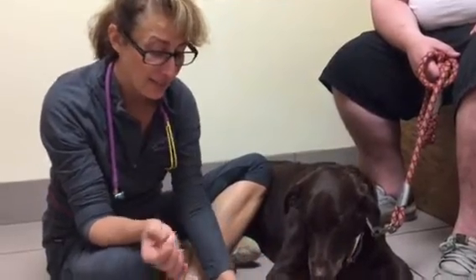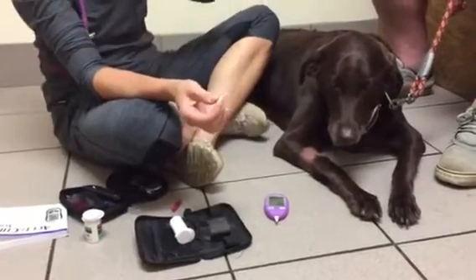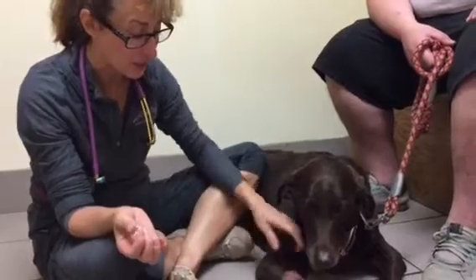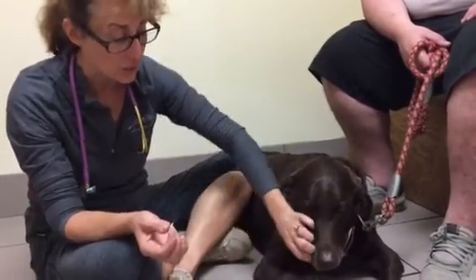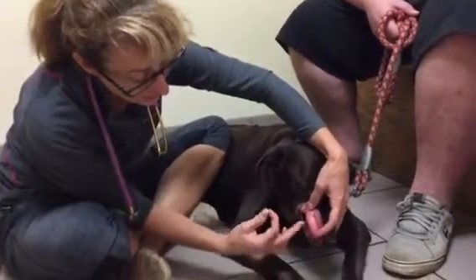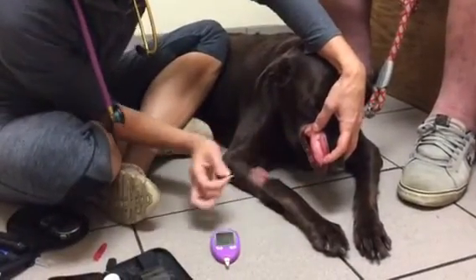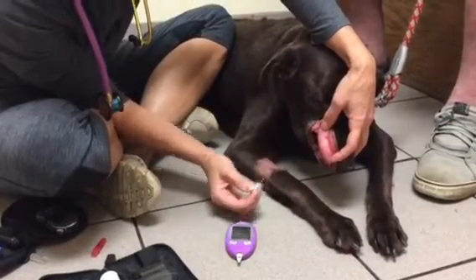We use an Alphatrack in the clinic — I think it's the best for dogs and cats, so that's what we use here. If they come with a lancet, I also think the lancet is the easiest thing to use. Typically in the clinic we use a vein, but we're going to try to do it so that we can send Ladybug home with her dad. The easiest thing for these guys is to use your lancet and then use the inside of the lip. We've got our glucometer ready — you have to follow the instructions for your glucometer to do that.